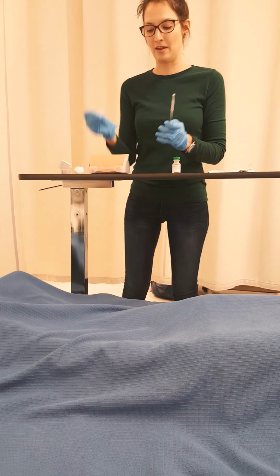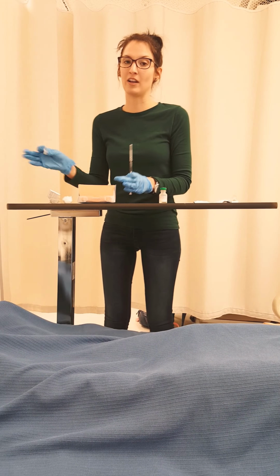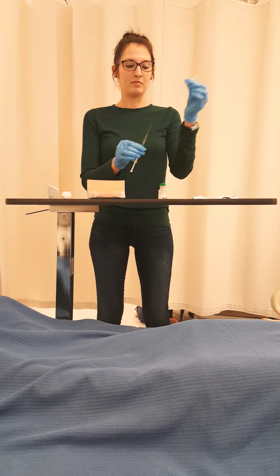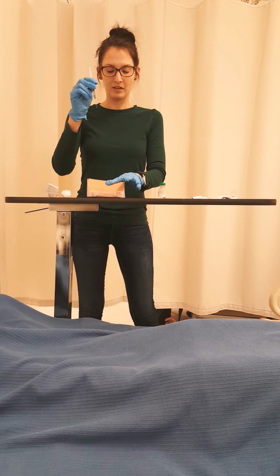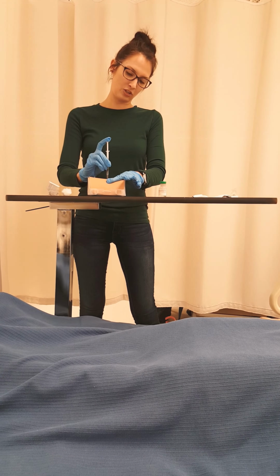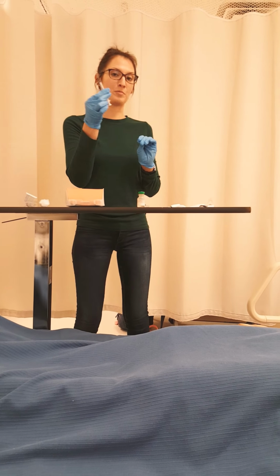So to prepare our site, we're going to clean it with an alcohol pad. We're going to let that air dry for comfort. Letting it air dry helps it to not sting. Uncap our needle. We're going to spread the skin. And in a dart-like motion, we're going to go into the muscle. Inject our medication. Let go. And this will go into the sharps container.